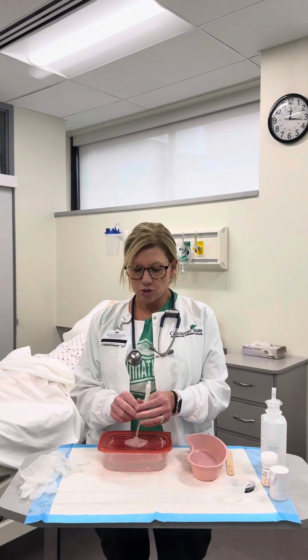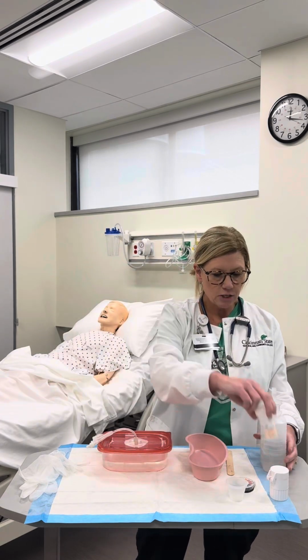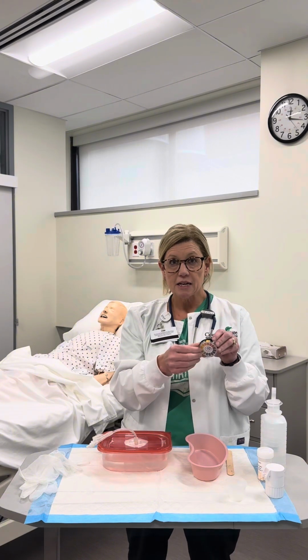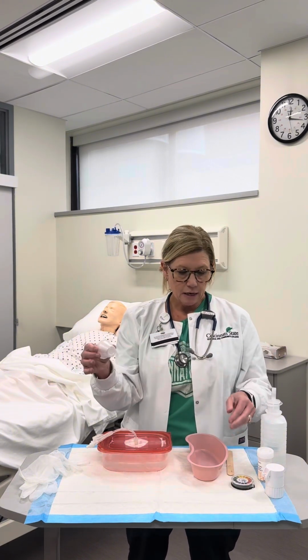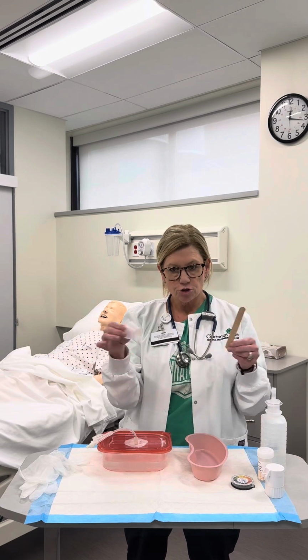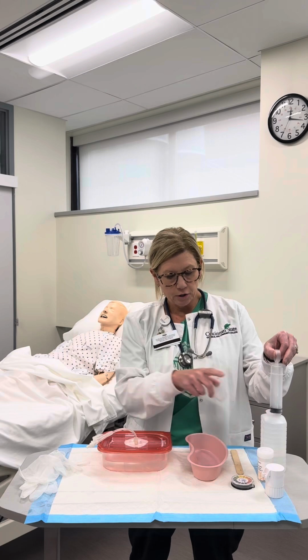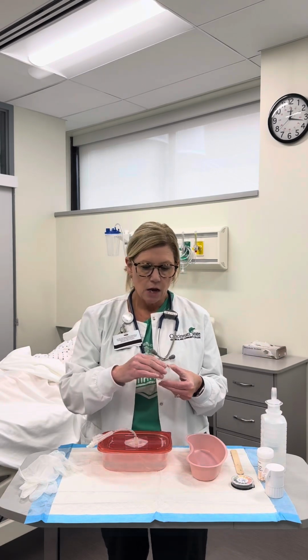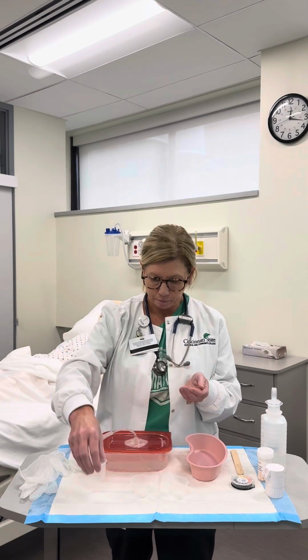This is my G-tube, my patient's stomach. I've got my medication, a pill crusher. I've got my pH strips. I need to have 3 medicine cups, something to stir my medicine with. And I've got my syringe, some water, and something to put my residual in, okay? So I want to go ahead and get my things set up.